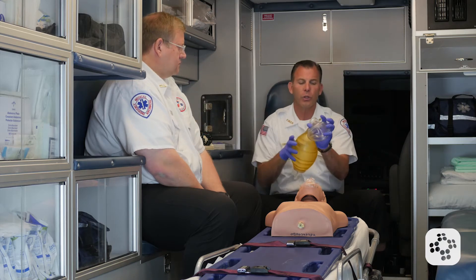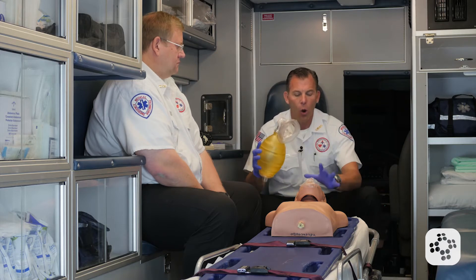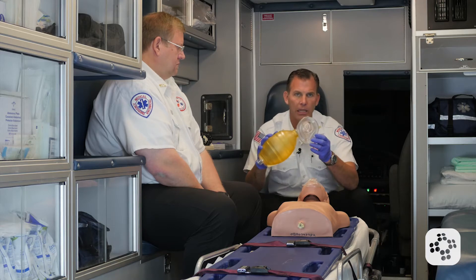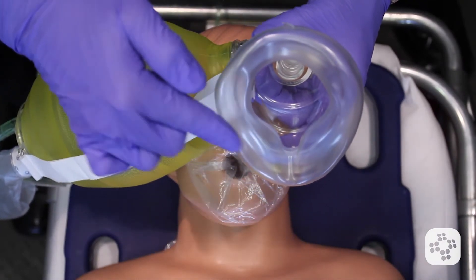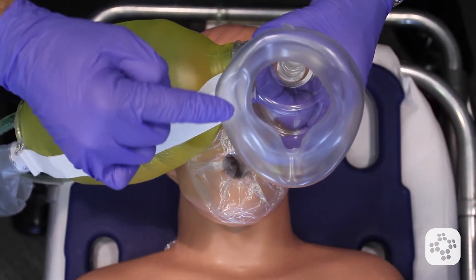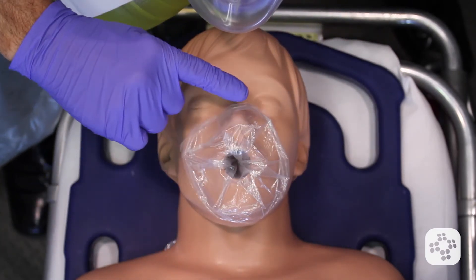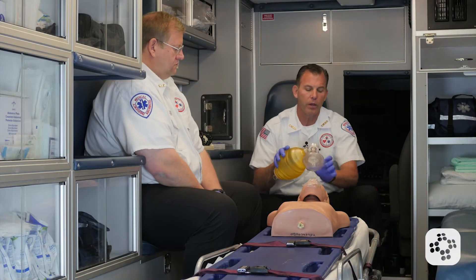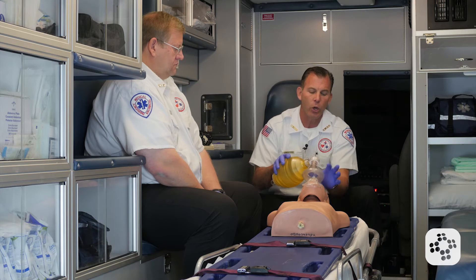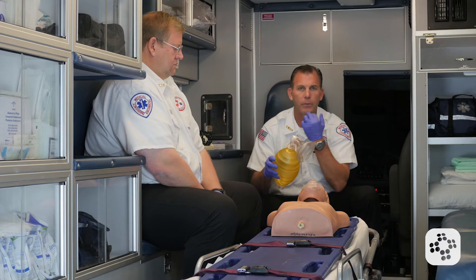When it comes to sealing the mask over the face of the patient, look at the shape of this mask. You have an apex that goes over the nose of the patient, with a bell on the other end that's wider — this should seal around the chin and face under the bottom lip. We bring the apex part over the bridge of the nose while the bell portion fits over their mouth and seals around the bottom side of the chin.